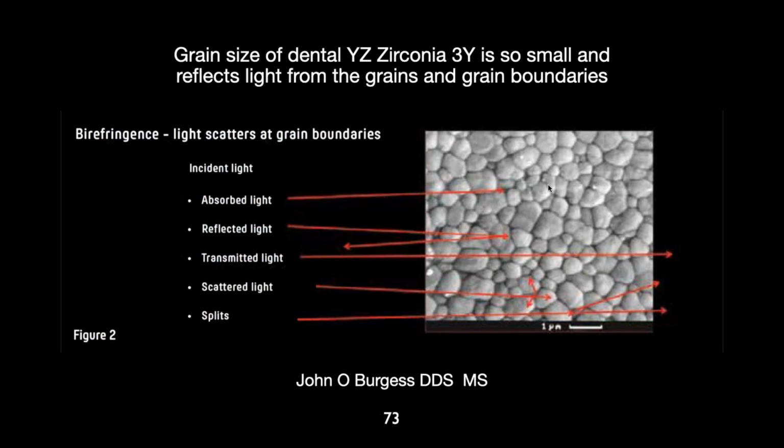And these materials are what they call birefringent, which is double refraction. And that's why they look, once you put it in the mouth, you have a black background. The teeth are allowing the light to go through, and this stuff is just bouncing it out so hard that you can't control that. And that's why you need to layer some porcelain on some of these crowns to reduce that and have a little light scatter and not so much pure reflection from that zirconia. The 5Y zirconia is a lot better, the more translucent one.